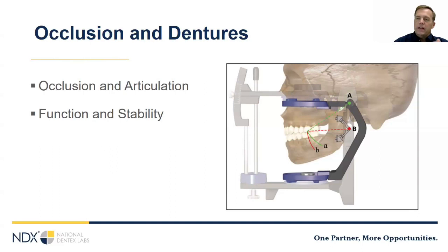As you guys know, edentulous and dentate patients articulate differently. Denture wearers tend to chew horizontally with only a slight vertical component, and dentate patients have that warped teardrop pattern with much more vertical movement. Because of this different articulation, we'll find that denture teeth need to be set differently, again, to get that stability that our patients need.